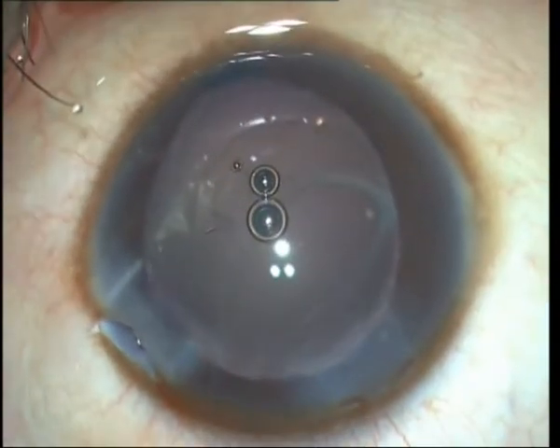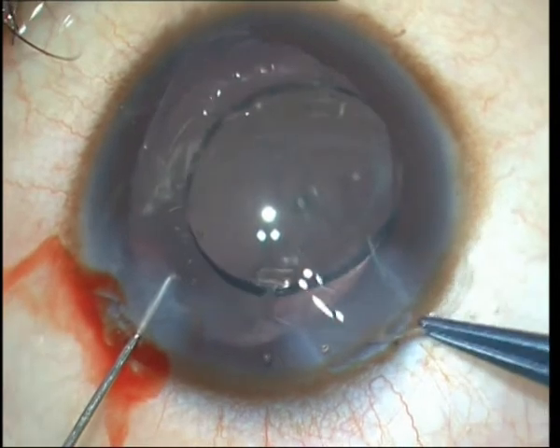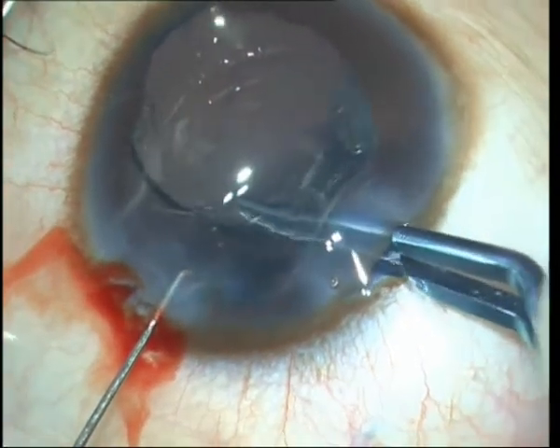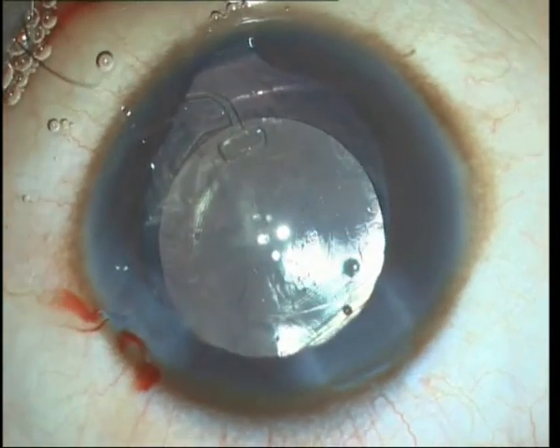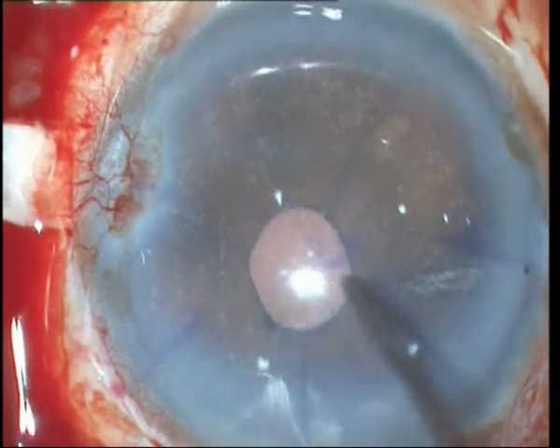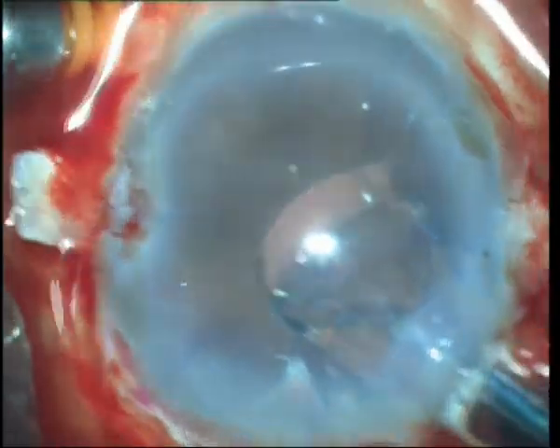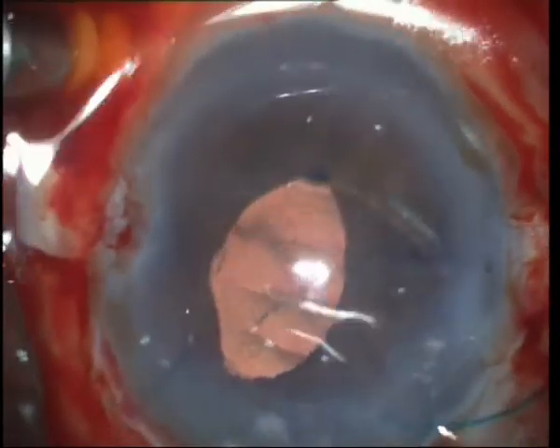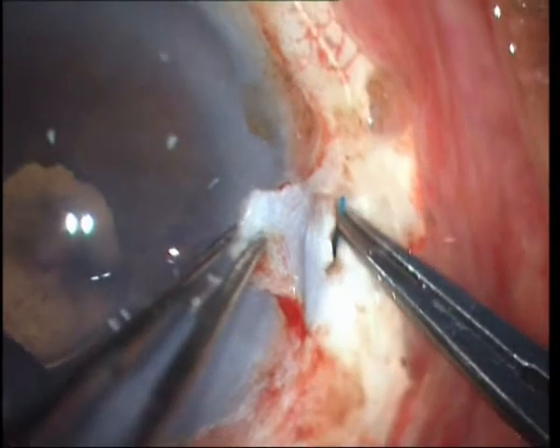In the event of a posterior capsular rent, it is not advisable to place a multifocal IOL in the sulcus for fear of postoperative decentration. If in the bag multifocal IOL is not possible, a glued multifocal IOL may be preferable as the IOL is very stable with no post-operative decentration of the IOL occurring from its intra-op positioning.